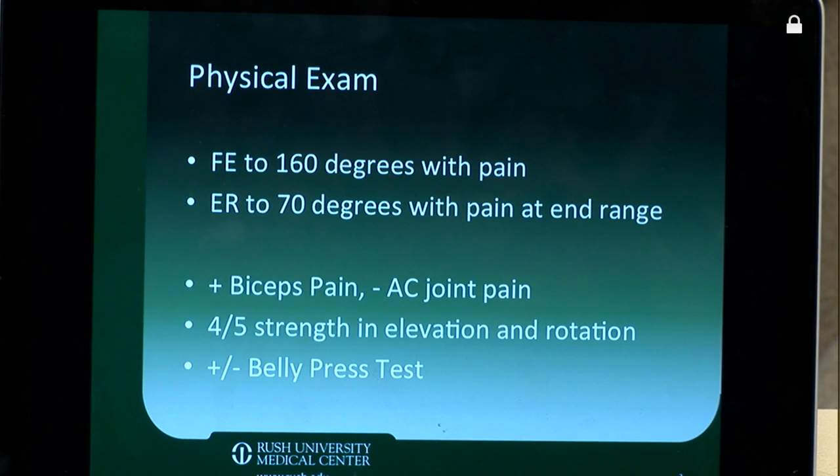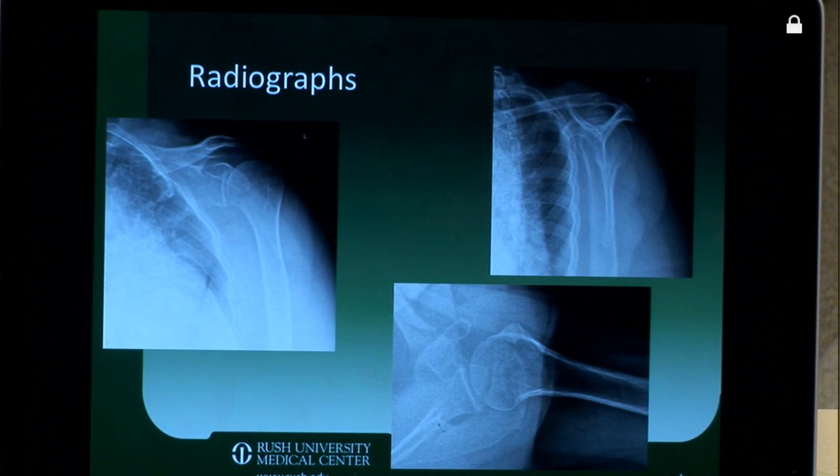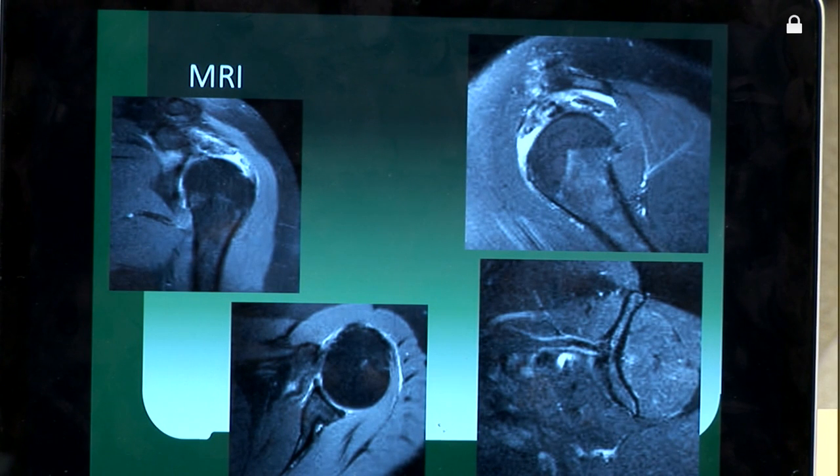She did have pain over her biceps with no pain over the AC joint. She has good strength although weakness pain-related in both elevation and rotation, and her belly press test is equivocal. You can see the standard radiographic series including an AP, a Y or outlet view, and an axillary view. Pretty well-maintained joint space but a type 2 to early type 3 acromion. On her MRI scan you can clearly see involvement of the supraspinatus. Unfortunately this scan was done in slight internal rotation which makes evaluation of the subscapularis a little difficult. We're going to look at that intraoperatively and her muscle is well maintained.